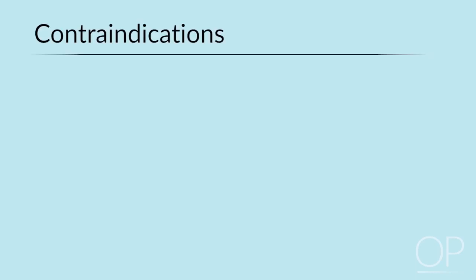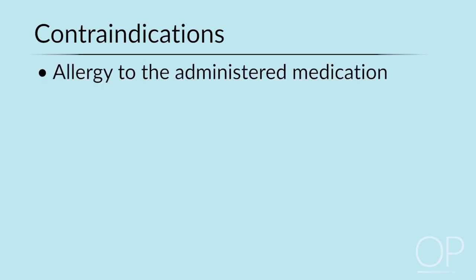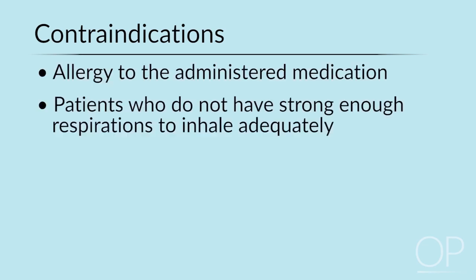Some healthcare providers would refrain from performing this procedure in patients with allergies to the administered medication, or who do not have a strong enough respiration to inhale the medication adequately.